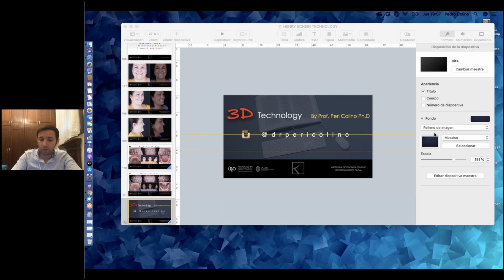This is the situation in which I decide to put skeletal anchorage. But from my point of view, the change is the same. The aperture of the suture is the same. If I give more turns, I obtain more distance, but it's the same.